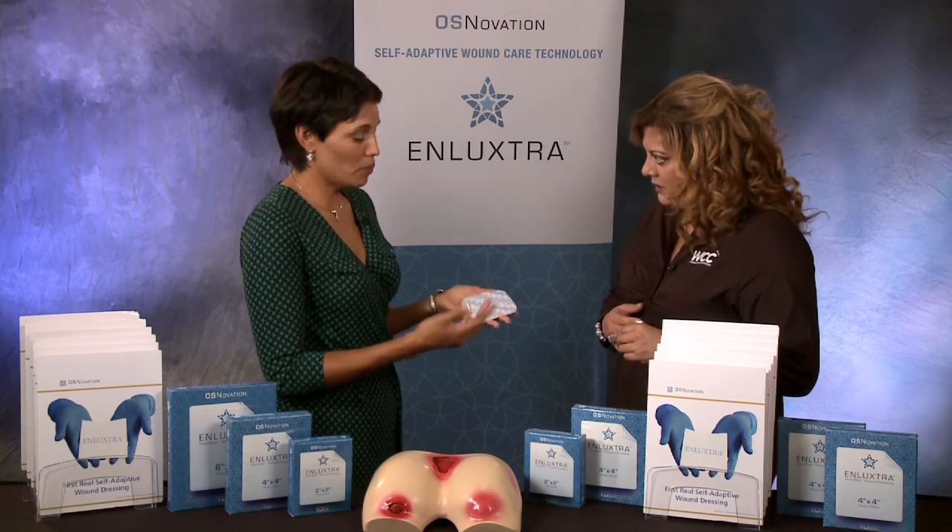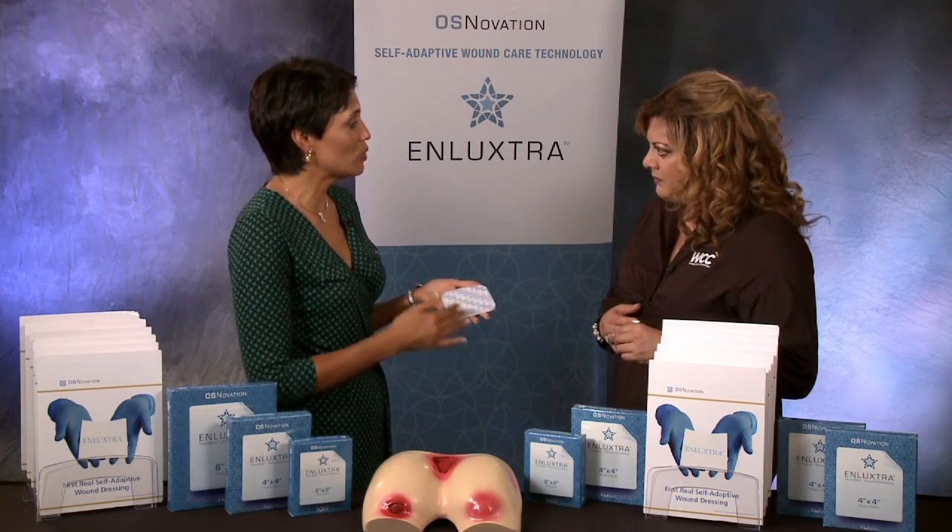An important factor: the drainage won't come through the dressing. Through the backing of this film, it will not get the patient's clothing stained or marked. Well, that's important. Yes, it is.